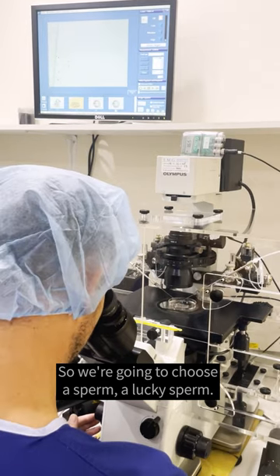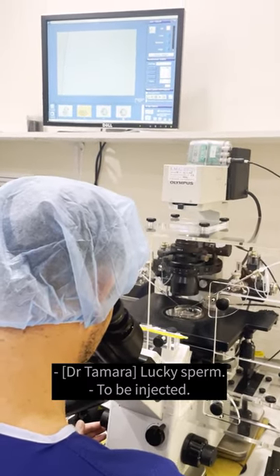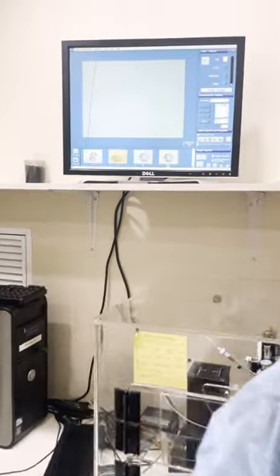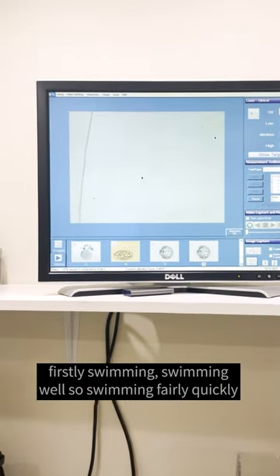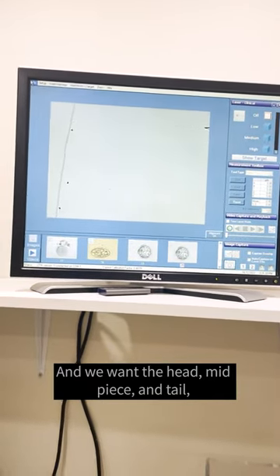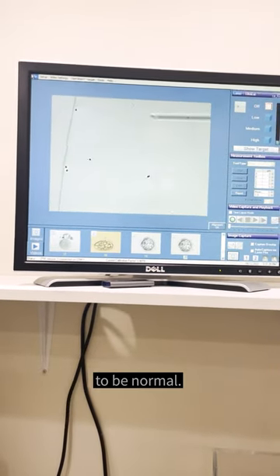So we're going to choose a sperm — a lucky sperm — to inject. What we're looking for here is a sperm that is firstly swimming well, swimming fairly quickly in a progressive straight line. And we want the head, mid-piece and tail, which are the three key parts of the sperm, to be normal.